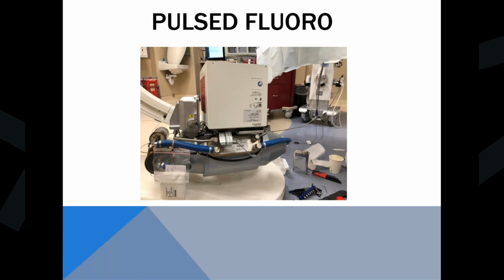What the filtration does is if you have a really big patient, then you can put in minimal filtration, and that will also cut the dose down and make for a better image. Or if you have some skinny little grandma that you put on there, you don't want to blast her with a big dose of radiation. It's not going to do anything for you. So that'll be skinny man or thin man, and then you'll have your normal sized patients. So there's a little more action going on in the collimator than on traditional systems.